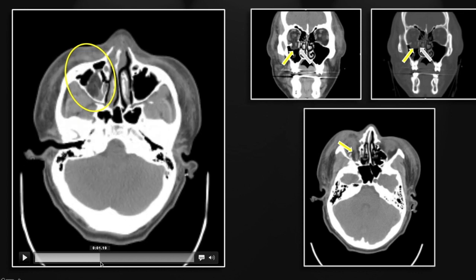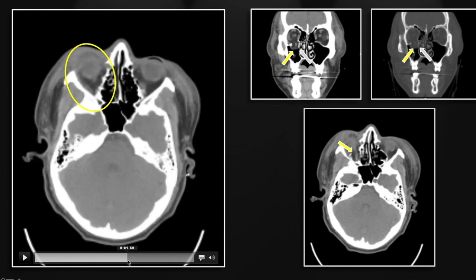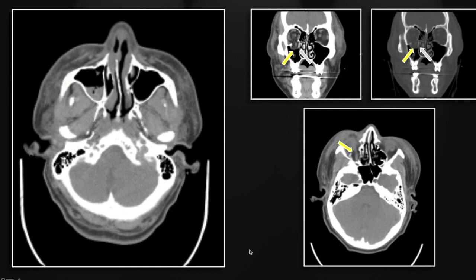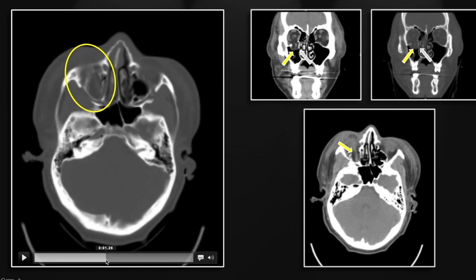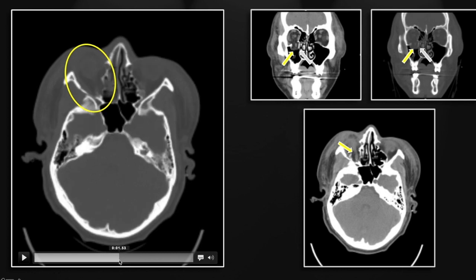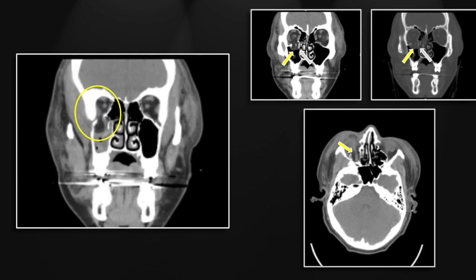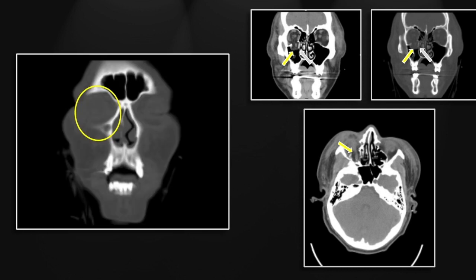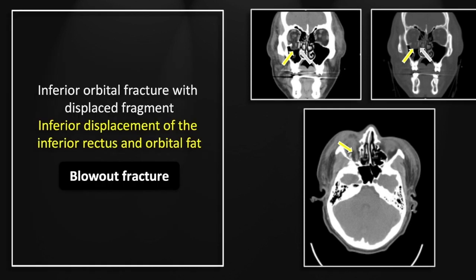You can see fluid in the sinus, the orbital fat herniating down into the sinus, the displaced inferior rectus muscle, and some retrobulbar hemorrhage as well. On the bone window you can see the displaced trapdoor fragment quite nicely in the medial aspect of the maxillary sinus. On the coronal: the herniated fat and herniated inferior rectus muscle, and on the bone windows that displaced orbital floor fragment. That is a classic inferior orbital blowout fracture.